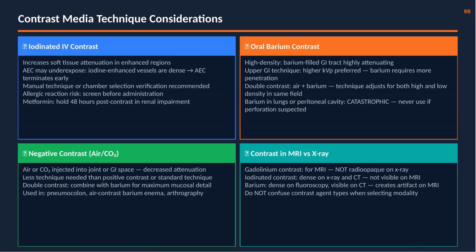Iodinated IV contrast increases soft tissue attenuation in enhanced vascular regions. The AEC may underexpose because dense iodine-filled vessels trigger early termination. Verify technique is within expected range.